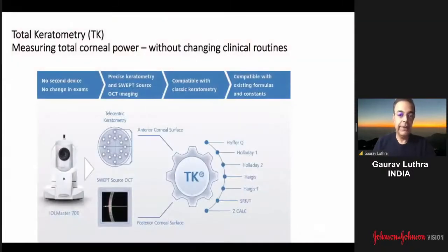So another thing which gets integrated with the IOLMaster 700, and I'm not a user and I have no financial interest, is the total corneal power. So it gives you the TK. Now, there have been mixed opinions about the value of the TK, as Dr. Douglas Koch as well pointed out about its utility for healthy normal eyes.